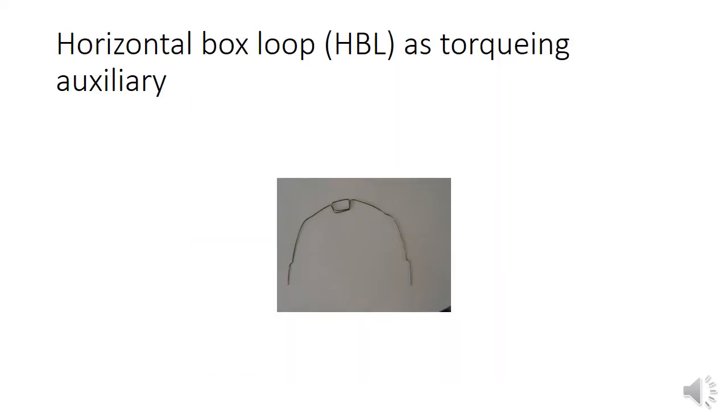But if you turn it inside the dental arch 90 degrees, when you want to engage it in the bracket, it will make a couple of force and tries to torque the tooth in a labial crown torque direction. The 2 points of this couple are the segment of wire in the bracket slot and the segment of wire leaning on the cervical part of the tooth.